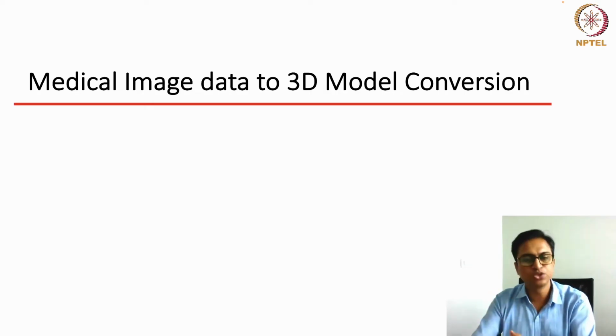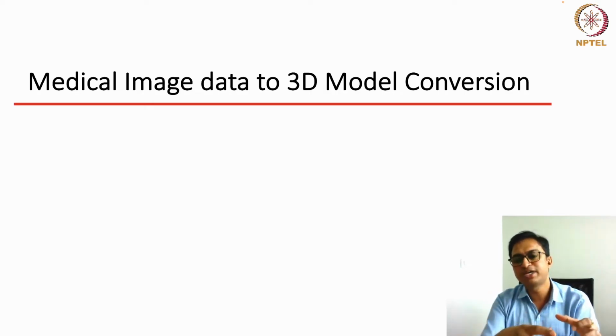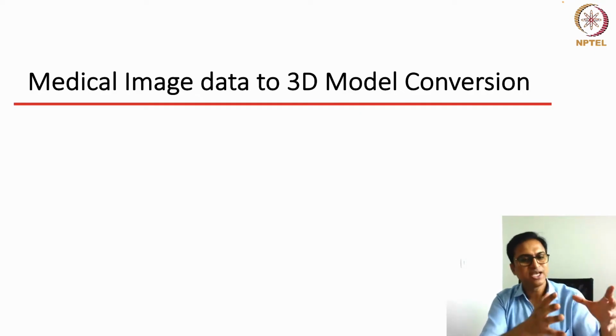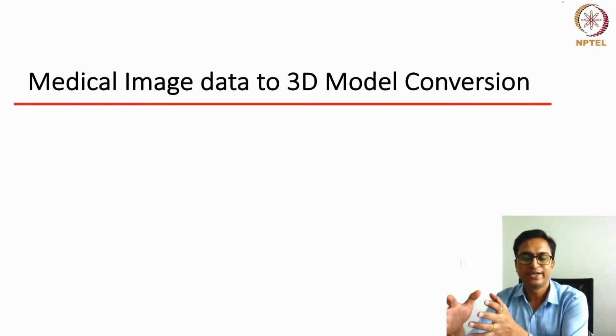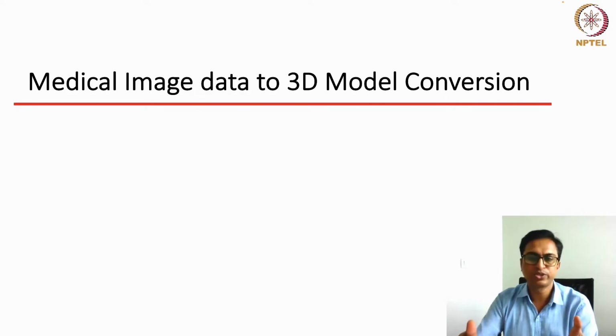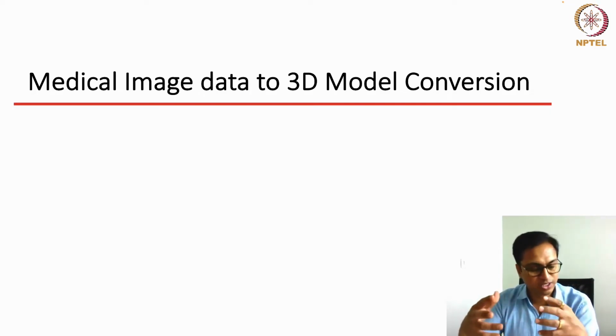So there are ways to do that. Another thing to remember here is that this medical image data is mostly in DICOM format. Then it is our job to convert this DICOM format, the medical image data present in slices, into an STL file. What are the different ways we can convert them, what are the different software we can use, and how can we manipulate that with the 3D printing technique.